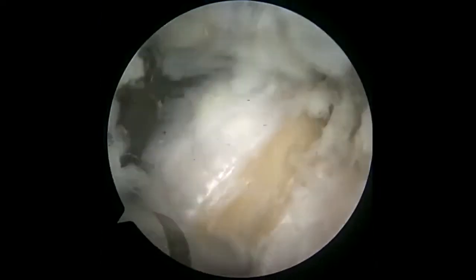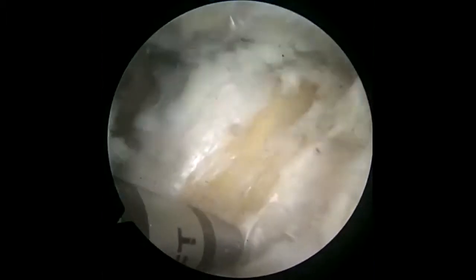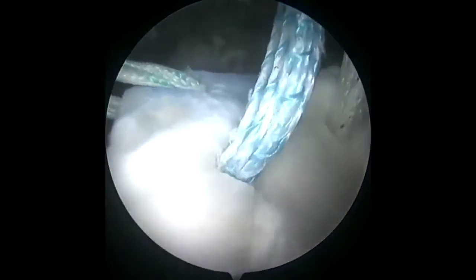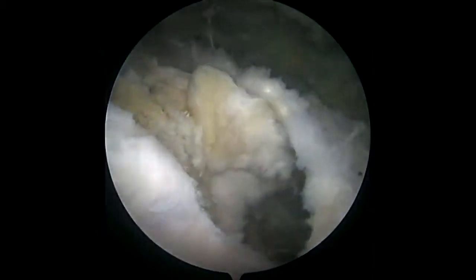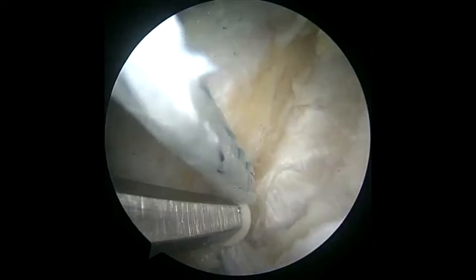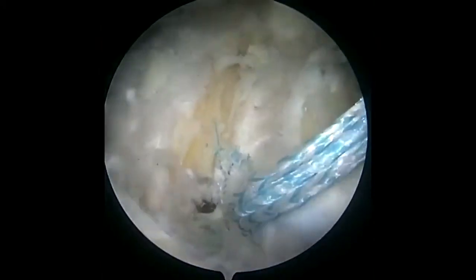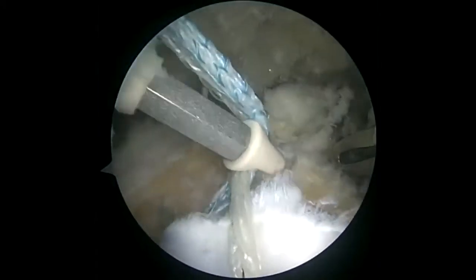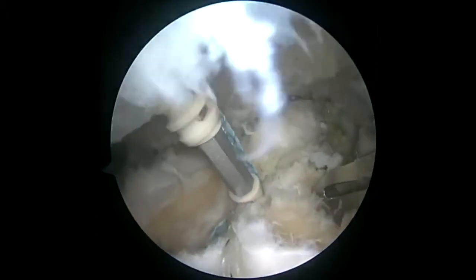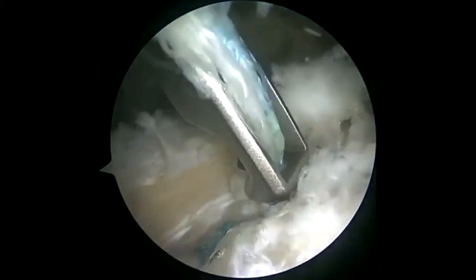After the two holes are punched in the bicipital groove, one limb from each suture anchor is then retrieved and loaded into the knotless anchor. The anchor is then inserted into the superior hole located in the bicipital groove. The second suture pair is loaded into the second anchor and inserted into the inferior hole, completing the double row repair.